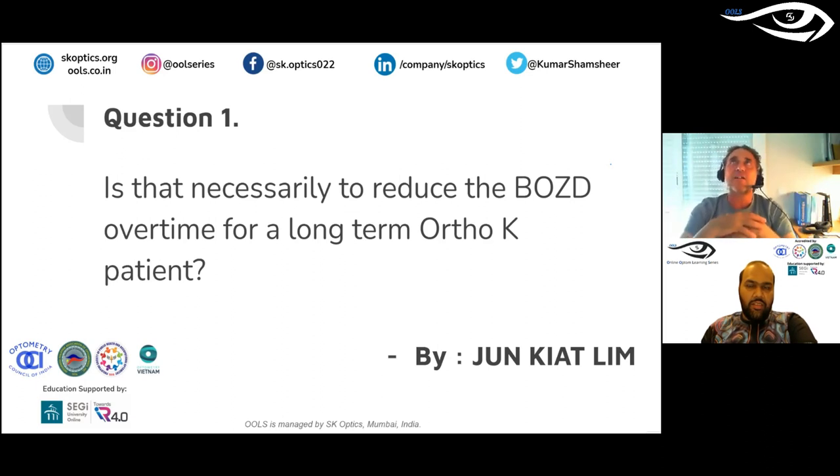And that was a trend to avoid complaints from the parents saying, "Oh, my child is telling me that she's seeing colors or halos around, or fogging around the lights," to avoid this. But what I discovered is, preferably you say nothing, and at the moment the parent or the child says, "I'm not seeing clear," your answer is yes, that's normal.